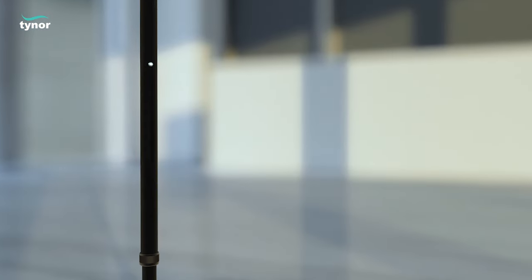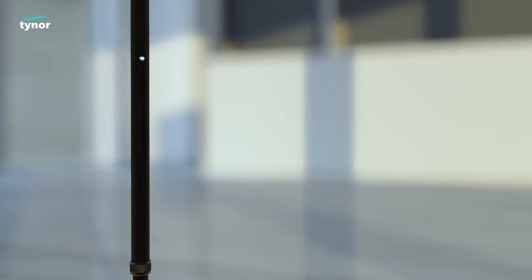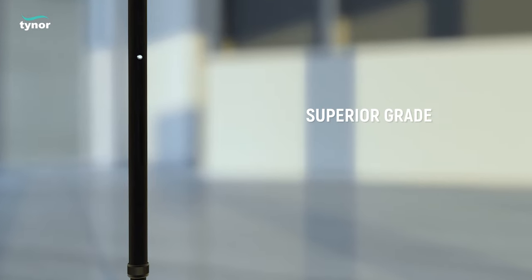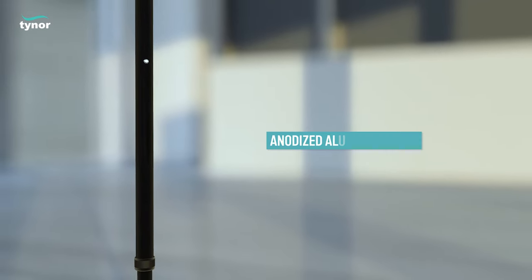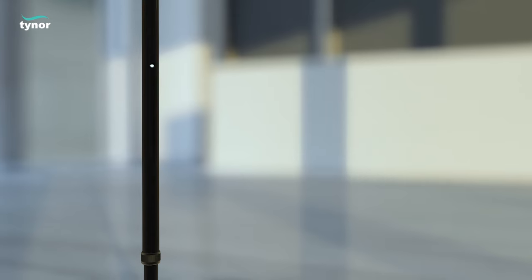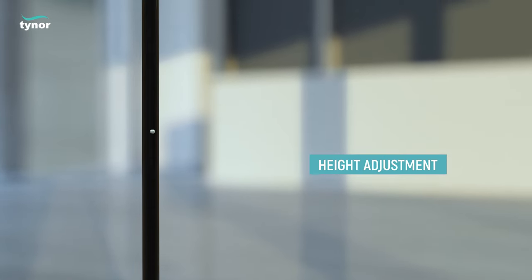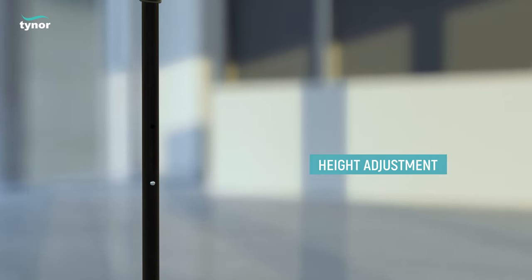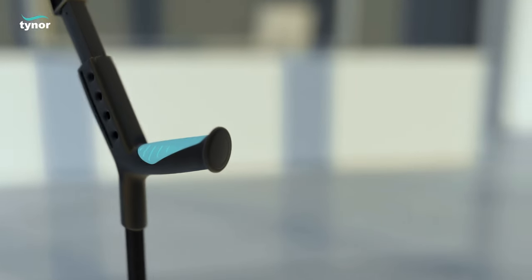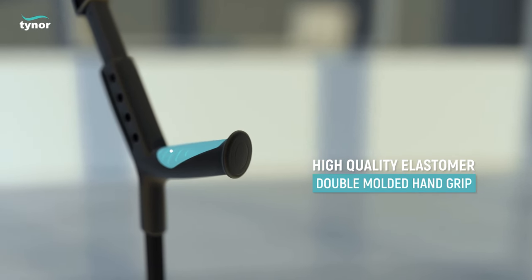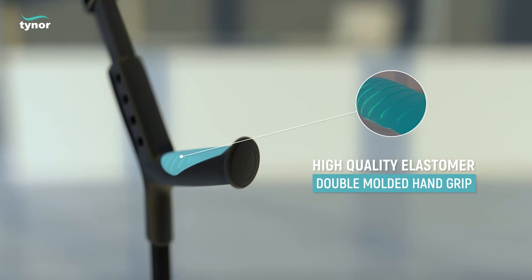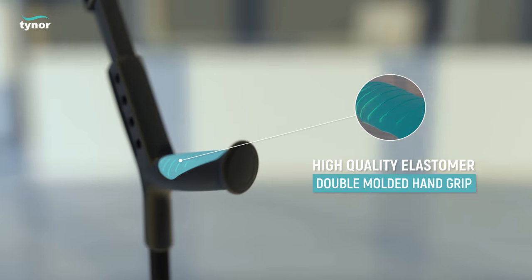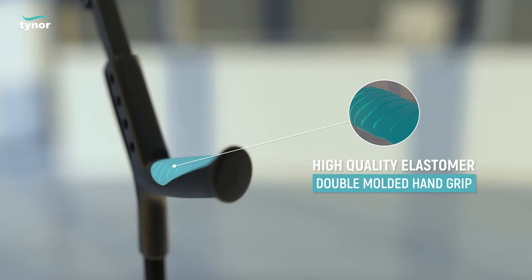The elbow crutch adjustable is constructed from superior grade high-strength anodized aluminum alloy. Its telescopic tube can be adjusted to achieve proper height. It comprises of high-quality elastomer and double-molded hand grip for enhanced cushioning and comfort.